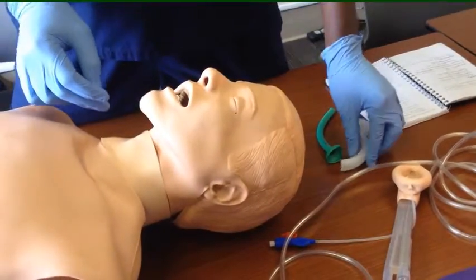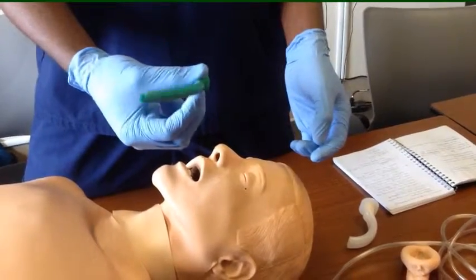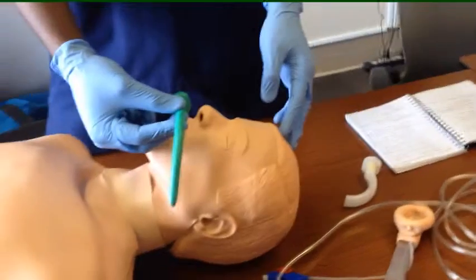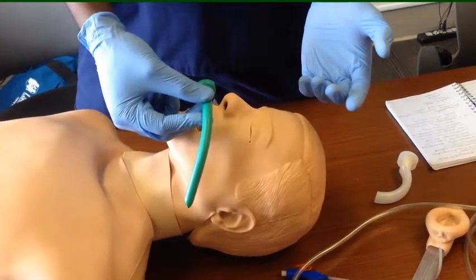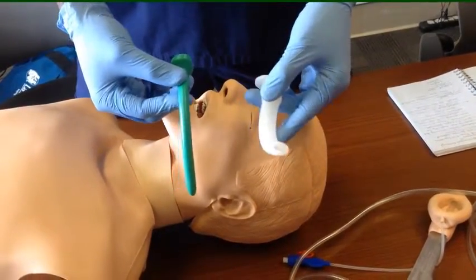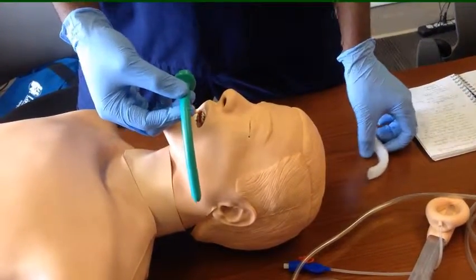And the same thing applies to the nasopharyngeal airway. This is how it looks. And when do we use it? For this one, we use it for the patient who is maybe semi-conscious. Also, if the patient has a gag reflex, we may use this one, because if we use the oral pharyngeal airway, the patient may end up vomiting upon you. So we don't want that to happen.